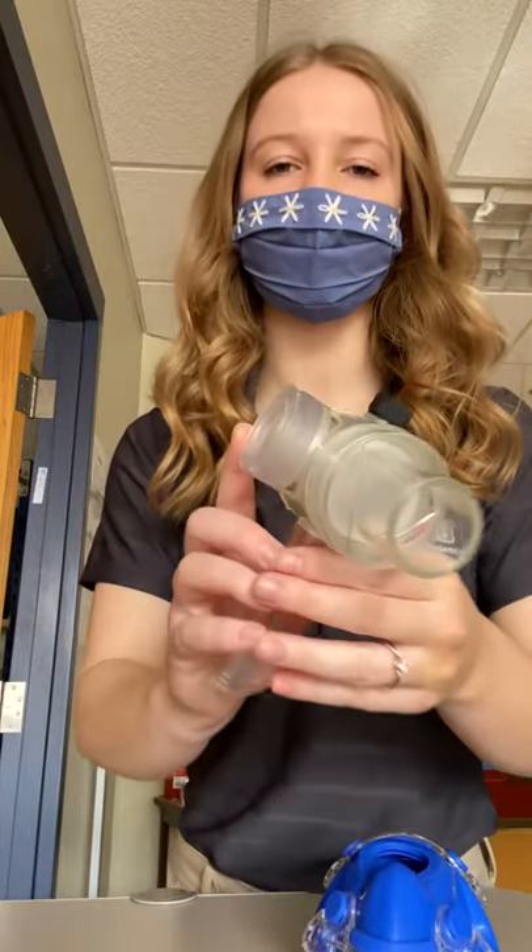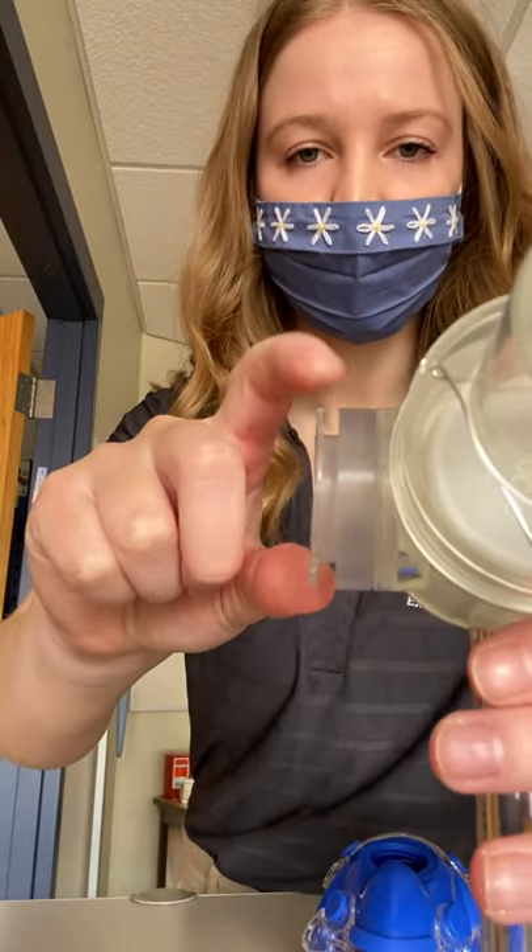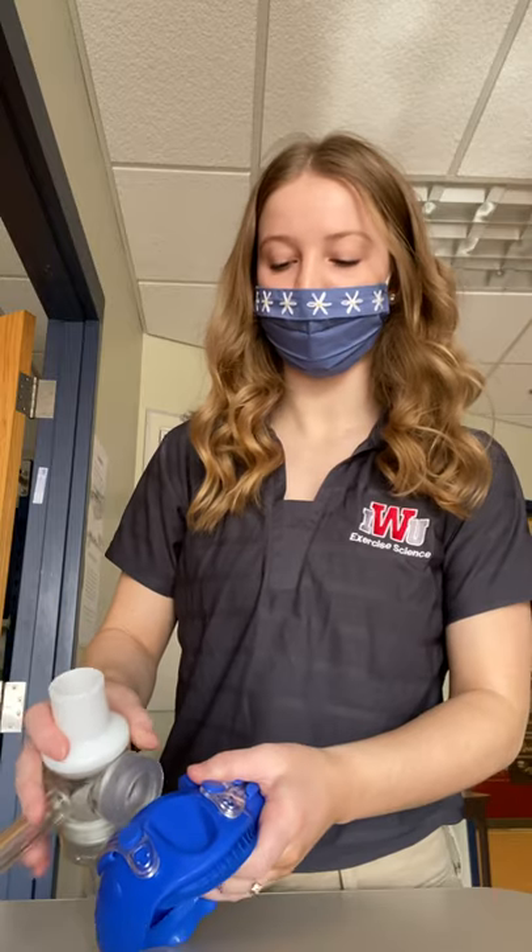You can see there's kind of a little lip right here that goes into this part of the mask. I like to set the mask down on the table — this part's really tricky, especially the first time you do it.